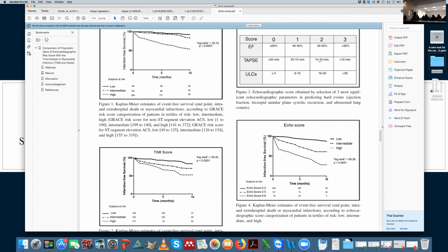Yes. I saw in your slides that, speaking about limitations of lung ultrasound, which is very important, because we now have many people still staying outside lung ultrasound and making much criticism about it, saying that there are no randomized studies about lung ultrasound to be accepted. That is something that, for me, doesn't exist. I mean, there is not only a scientific reason to say that. It's not scientific, but it's something linked with the psychology of the establishment. I don't know how to explain.